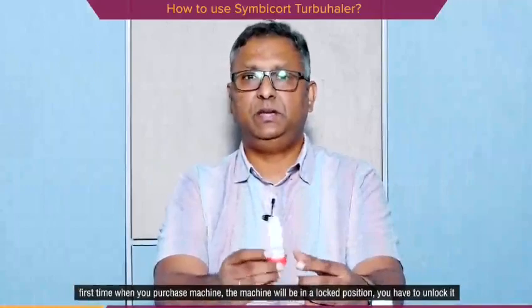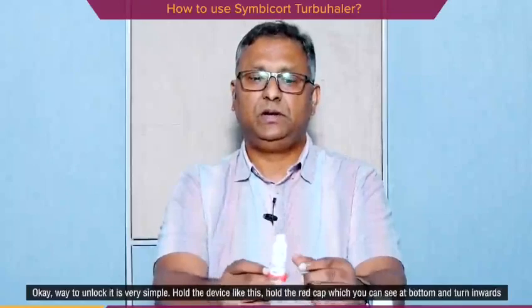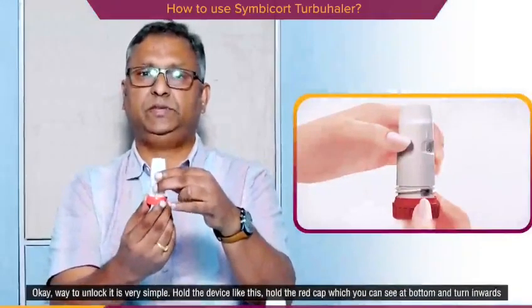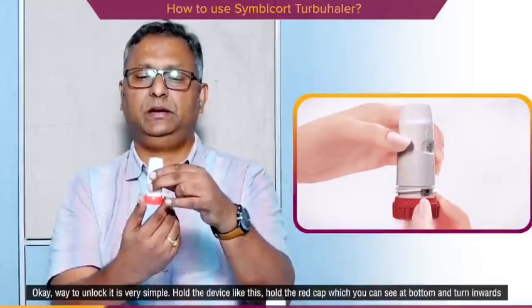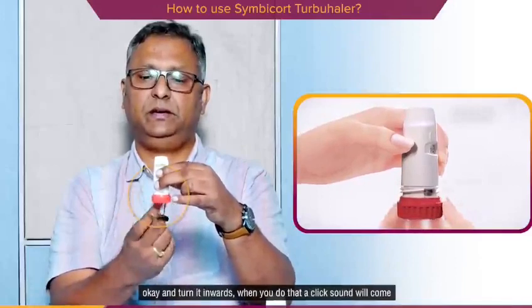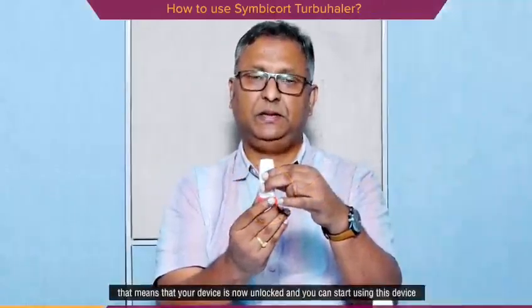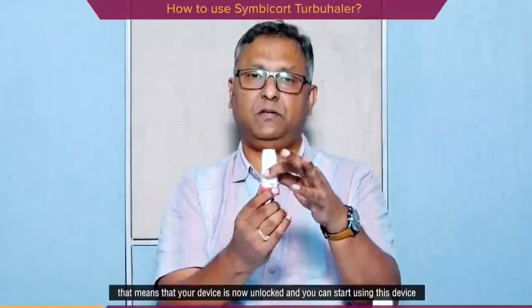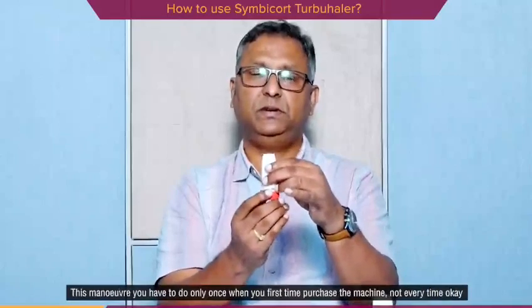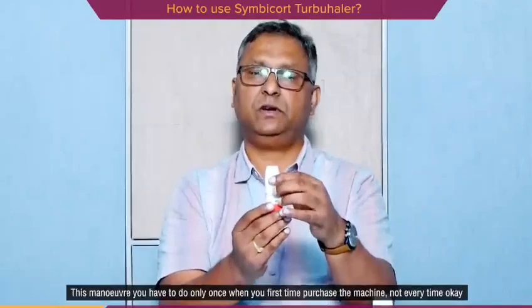the machine will be in a locked position. You have to unlock it. The way to unlock it is very simple. Hold the device like this. Hold the red cap which you can see at the bottom and turn it inwards. When you do that, a click sound will come. That means your device is now unlocked and you can start using it. You have to do this maneuver only once, the first time you purchase the machine, not every time.